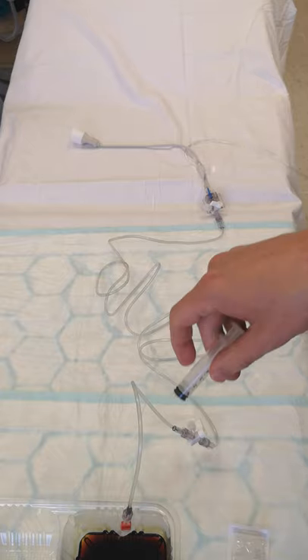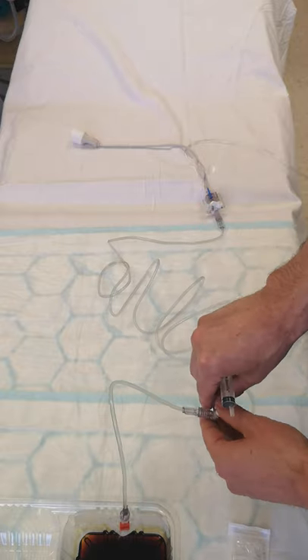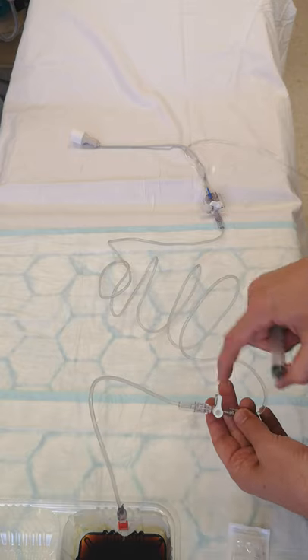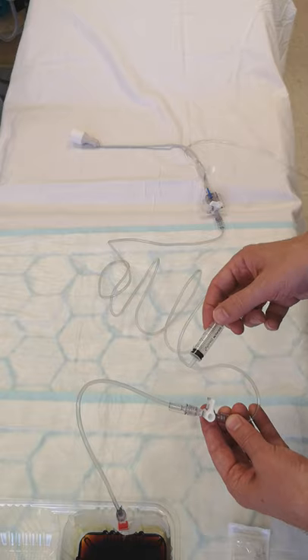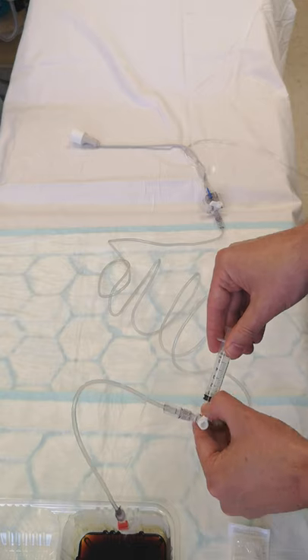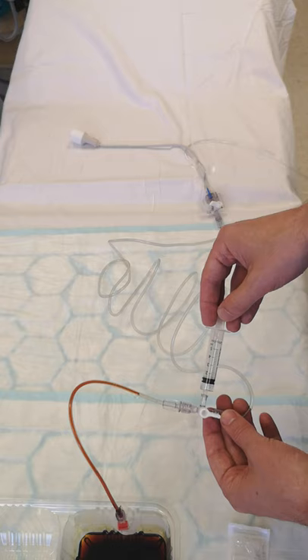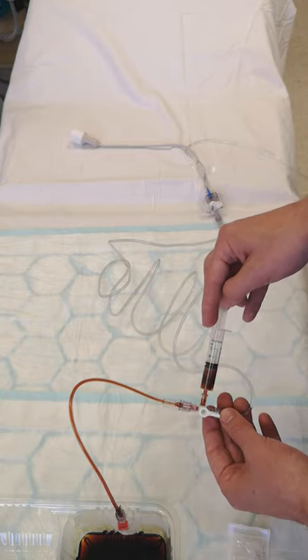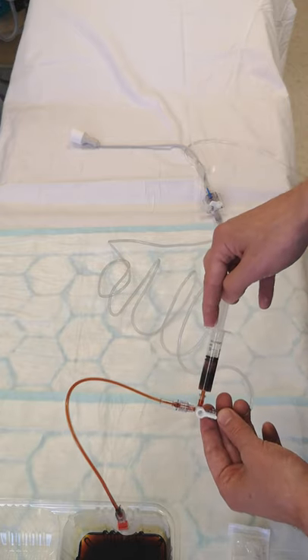Because the tubing is filled with saline, the first syringe is used to aspirate and discard that saline. Make sure the stopcock is off to the cap before you take it off, otherwise it'll leak. Put the syringe on, turn it off toward the patient, and start aspirating — about five mils — to make sure this section of tubing is full of blood.